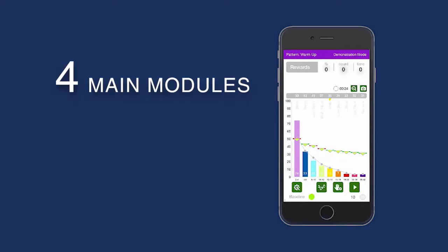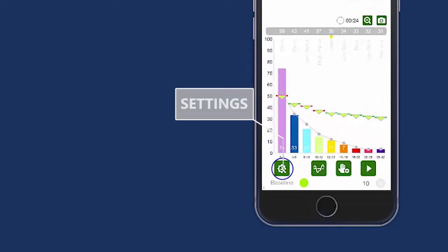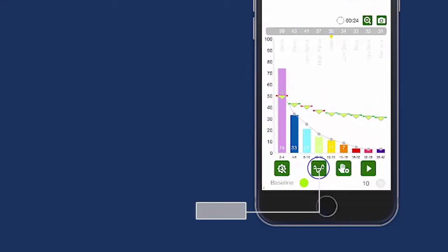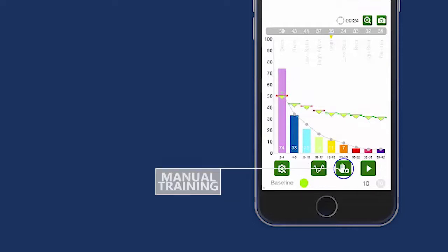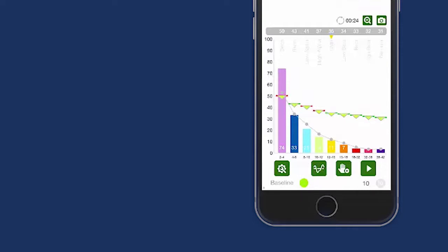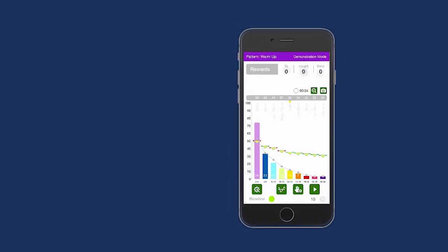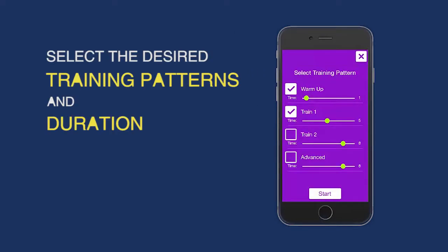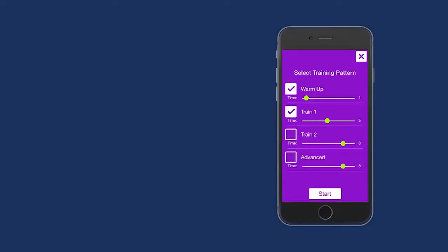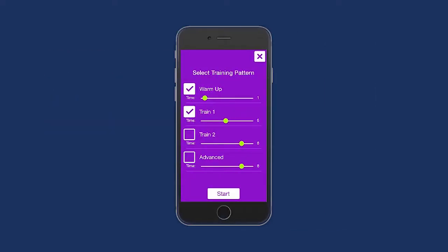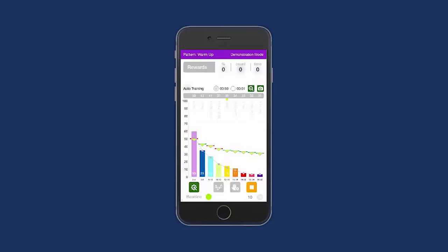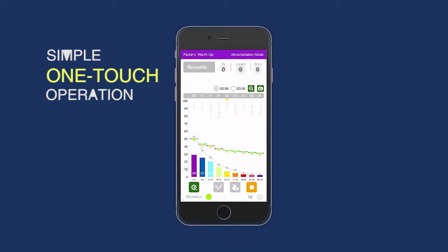There are four main modules: Settings, Fino, Manual Training, and Auto Training. Auto prompts the user to select the desired training patterns and duration, then guides the user through the entire selected training process, making the system a simple one-touch operation.